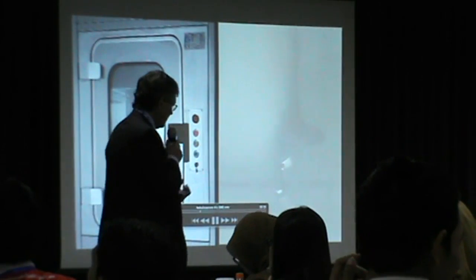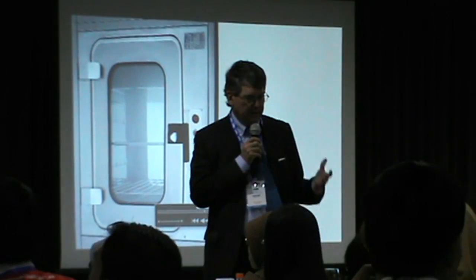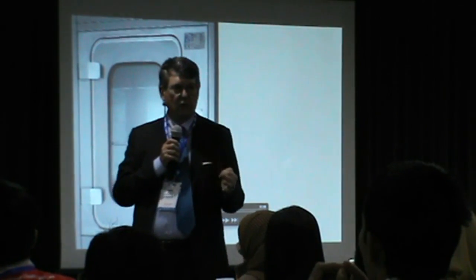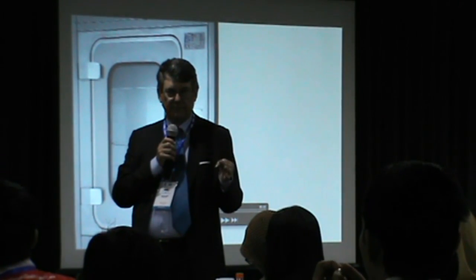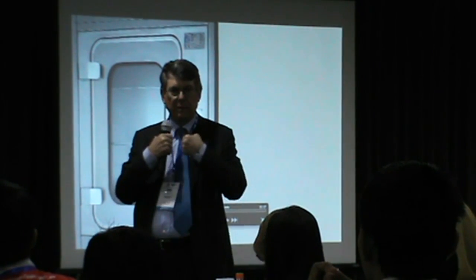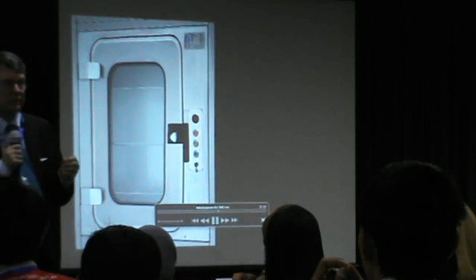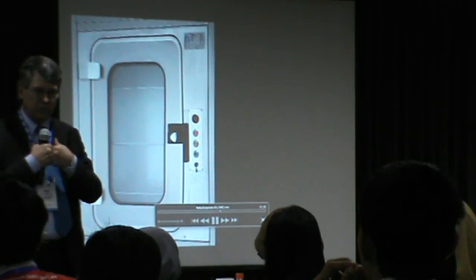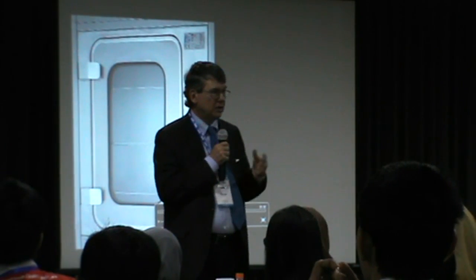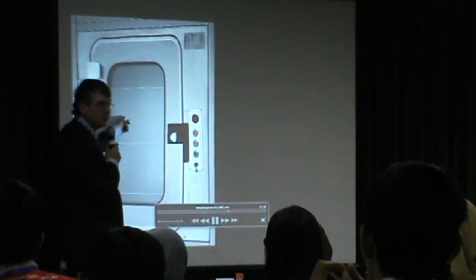And this mist has some physical properties that are very special. It means that the size of these droplets makes the droplets hard, very hard. So when they touch together, they bounce, and they don't stick. They are bouncing together, and also they are bouncing on the surface of the enclosure and the material. As you can see here, there is no condensation, no larger droplets.